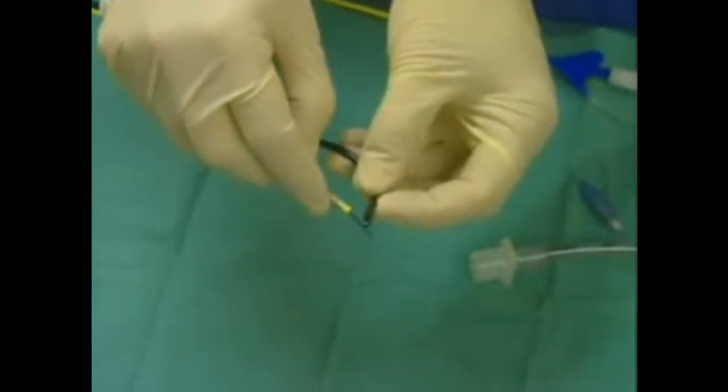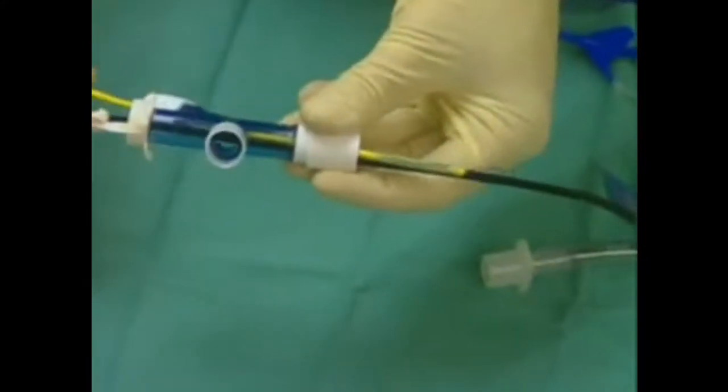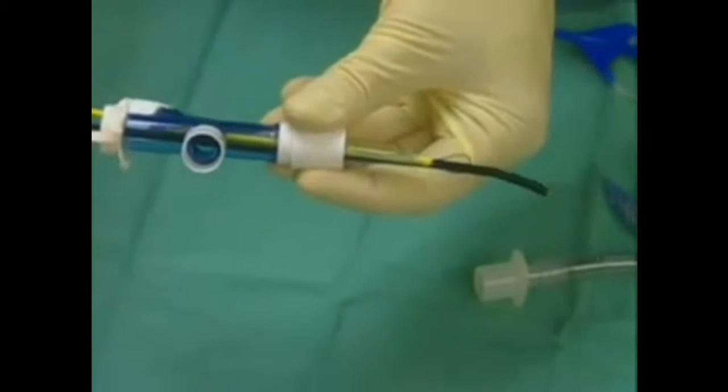This may be done within the multi-port adapter, endotracheal tube, or within the trachea proper. The endobronchial blocker and bronchoscope may also be coupled together prior to attachment of the multi-port adapter to the endotracheal tube. This coupling allows the endobronchial blocker to follow the bronchoscope. The guide loop can be adjusted to facilitate proper approximation.